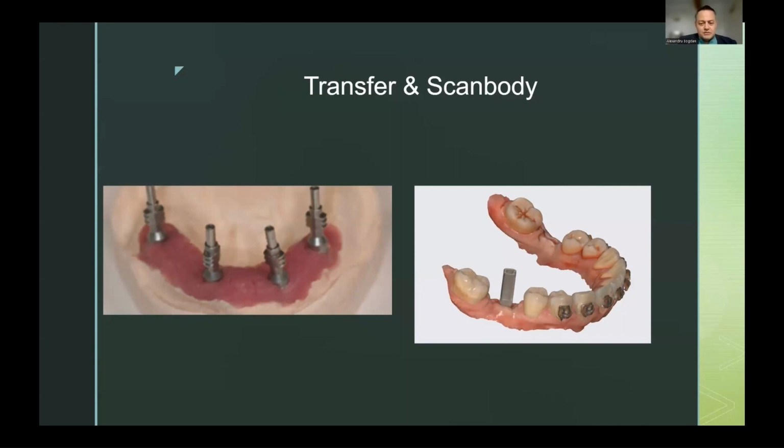After imaging the patient, the scan body is seated, and a new digital impression is done that contains the relationship of this scan body and the scan body itself to the mouth of the patient, teeth, gingiva, and after this mesh is done, the computer will then be able to take from the library the perfect structure, the perfect surface of the scan body, and will match it with what we scanned.